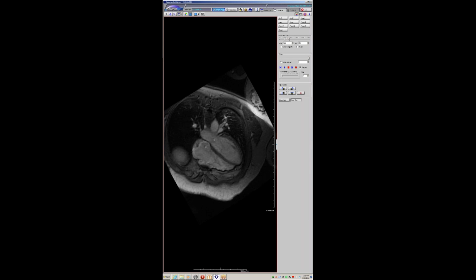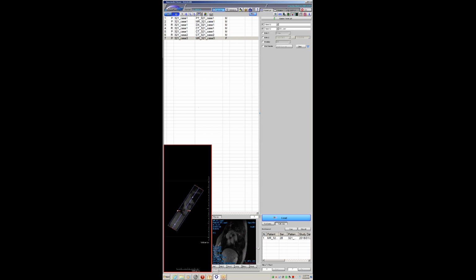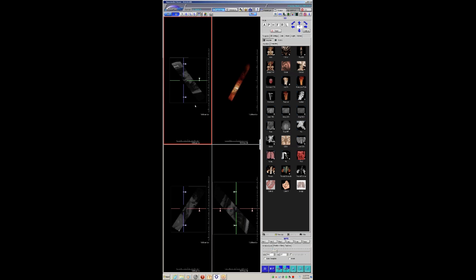I've only seen one other case of this, and it was from the NIH, of a patient with Carney's and multiple myxomas. So I'll send the MR and the echo cases. But all right, those are my cases. Thank you, Seth.